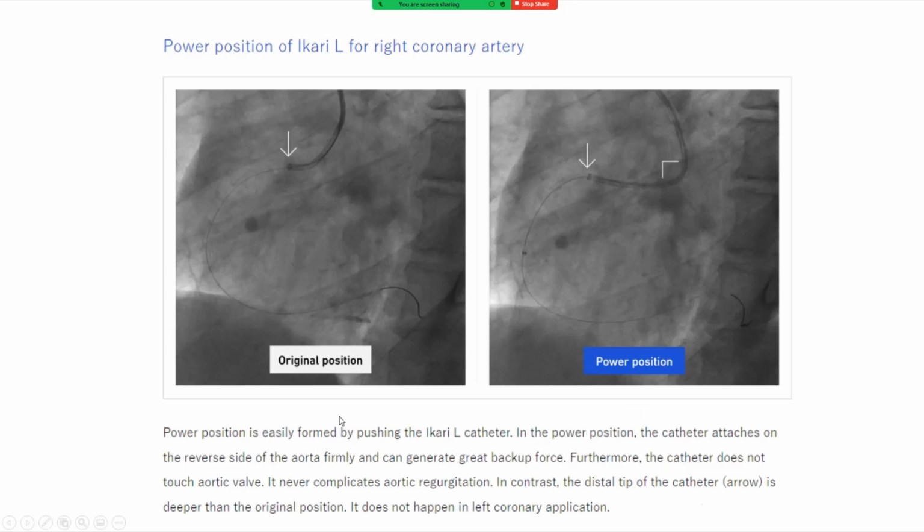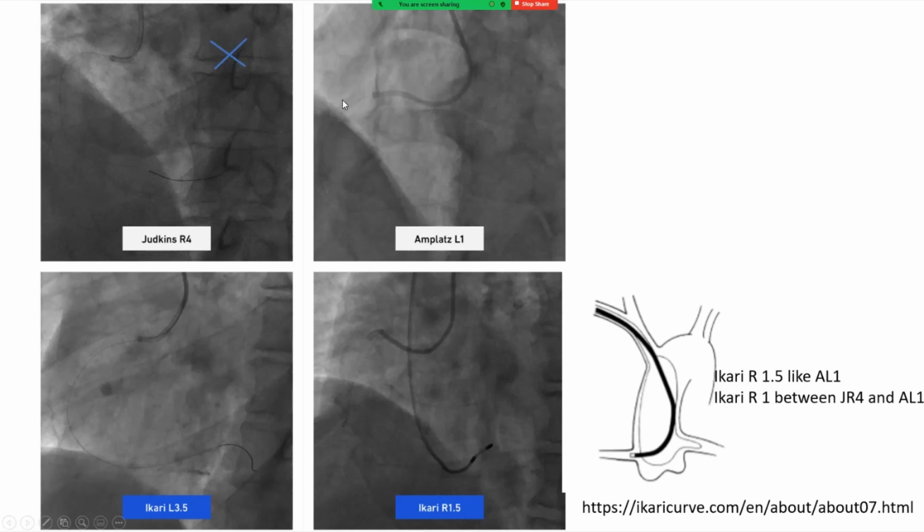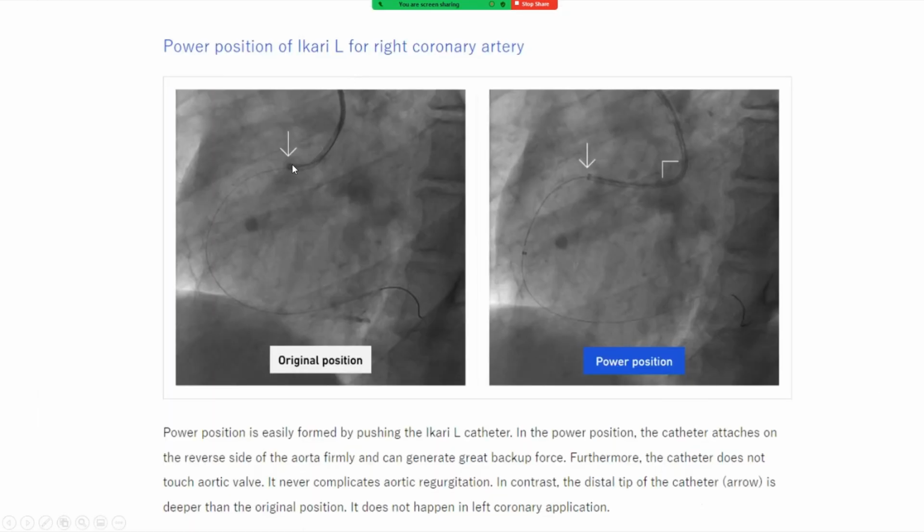Ikari Left by itself as a single catheter can be transformed from a JR4-like morphology to an Amplatz Left morphology. So you can engage it and maneuver it like a Judkins Right 4 with a short tip, or you can push it from that JR4 morphology into a power position and use it like an Amplatz Left with deep engagement support and opposite aortic wall support, sometimes even aortic cusp support. That's the beauty of it. It's one catheter that behaves like two.